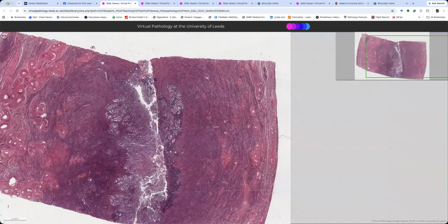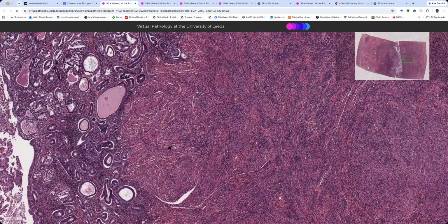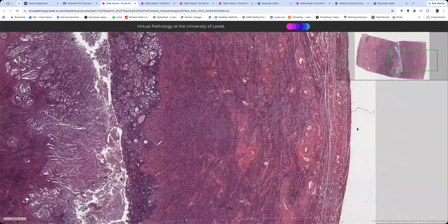So when cancers grow, they pull up strands of smooth muscle into the endometrium. So if it's vertically oriented smooth muscle, it's unlikely to be part of the wall where we've all got this kind of swirly, kind of going this way stuff. Okay, so that's a trick. If you can't measure the normal, measure the distance to invasion from the serosa, do the sum trick. That's the best way to measure them.